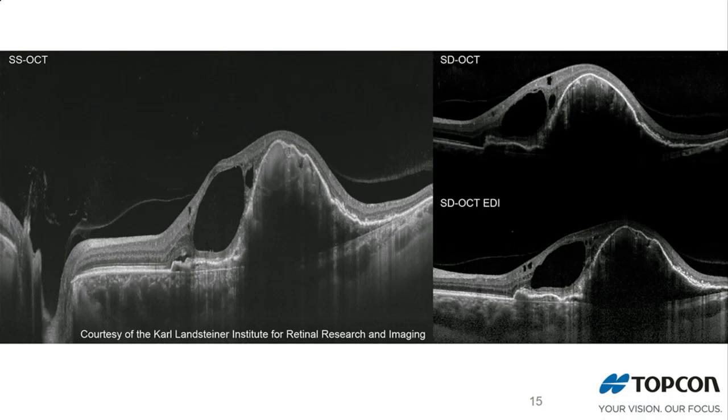Now, this becomes two very interesting things that we've done in the new software, and again, the international version of the software, is that if you've ever noticed on big pigment epithelium detachments, the segmentation always fails. Usually you'll have a weird segmentation that crosses diagonally through the middle of the RPE. It happens on all instruments, and for the life of me, I don't understand the reasoning behind it, because it's fairly clear, but it is what it is. So we're obviously working on improving that.